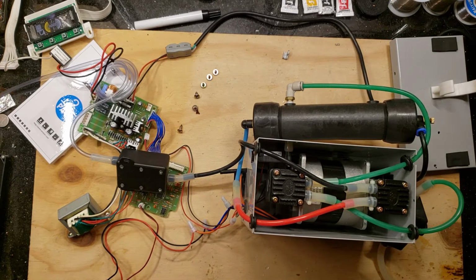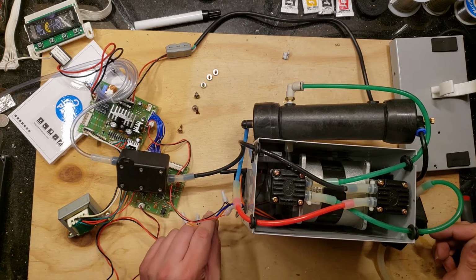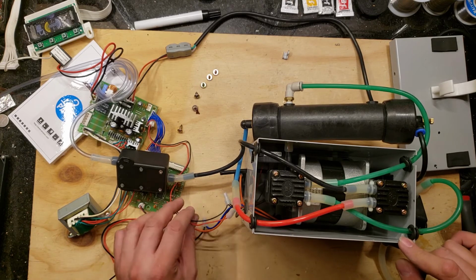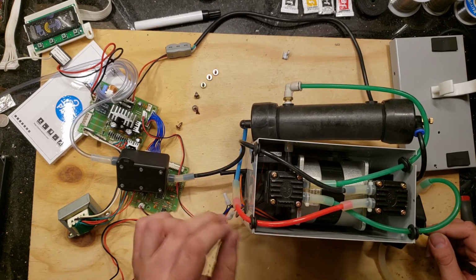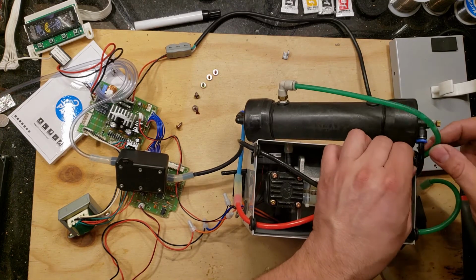In fact, what I think I'm going to end up doing is, since the compressor is 120 volt, I'm going to grab a little 5 volt or whatever. I don't see the voltage of those fans. I'm going to grab a little power supply and put it in here to power the fans, or maybe do a little capacitive dropper or something.